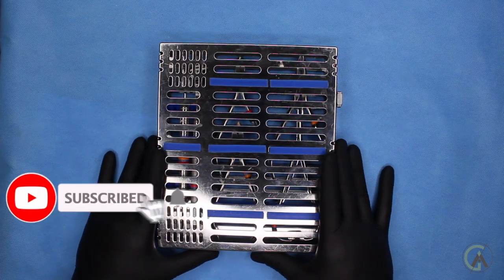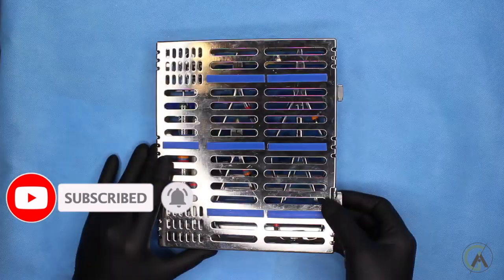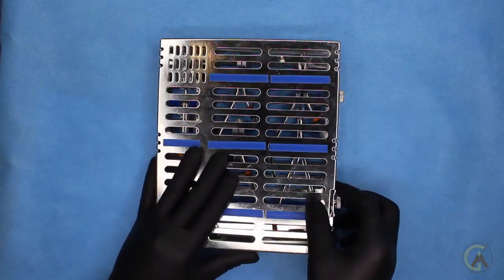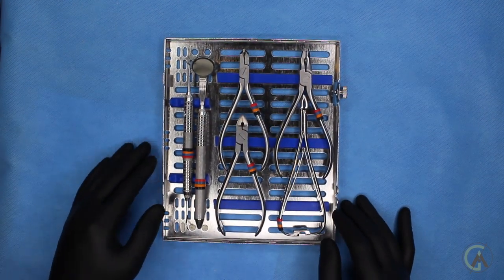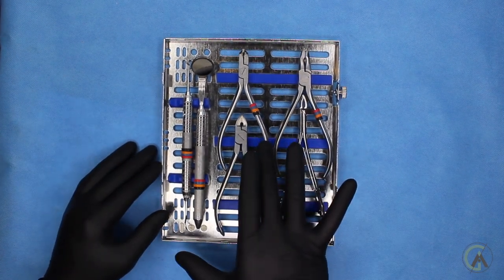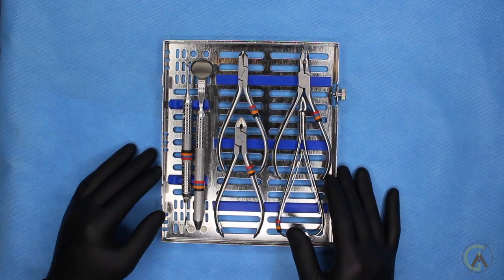So let's go ahead and look at what's inside a basic cassette and what the purpose of these instruments are. First we have to release these little tabs on the side, which lock the cassette closed in the autoclave. So the way these basic cassettes are laid out is we have a mirror and a picker, which has two sides and different purposes. We also have what's called a distal end cutter, a Weingart, a Mathieu, and a pin cutter — and I'll go over all of these in just a second.